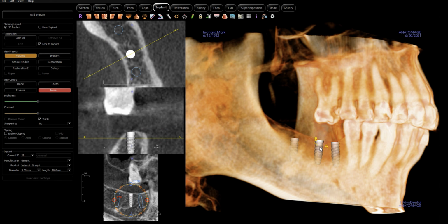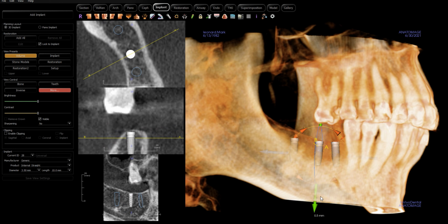What do I mean by that? Just like we talked about when we were trying to put the implant next to the natural tooth at a distance that's close enough so you have a natural emergence profile of the crown so that the soft tissue around it has natural contours. That same holds true here. The closer you put the implants together, the easier it is to have emergence profiles that support proper soft tissue between the implants.